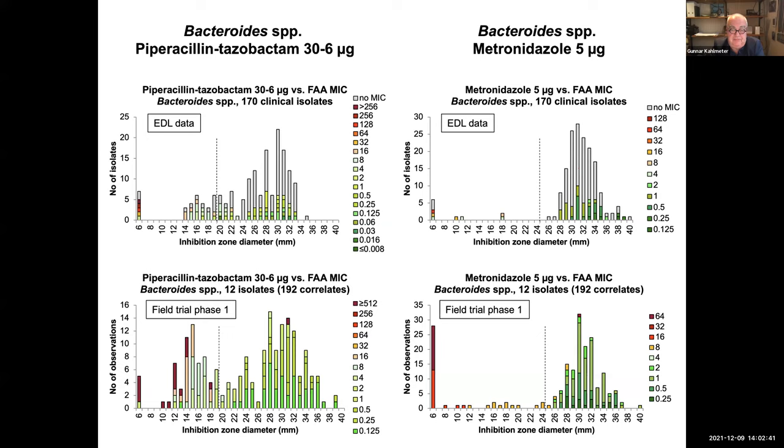And then there is another question. I'm unsure about the time the plates have to be in the anaerobic medium. This is a problem in our workflow. How do you all manage this? So the time you need to target is 16 to 20 hours. And I suppose the answer to that question is that you have to time the beginning of your incubation so that you can take them out of the thermostat, out of the workstation, out of the jars or whatever at the right time, namely a target 16 to 20 hours. Erica, Jenny, do you want to add anything?